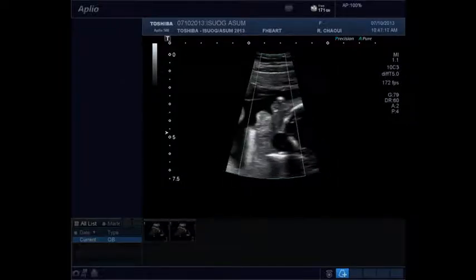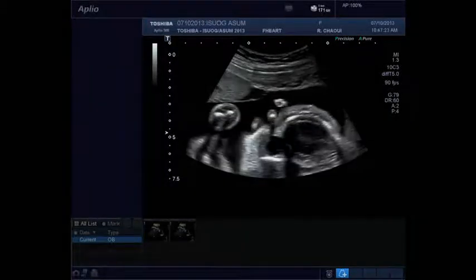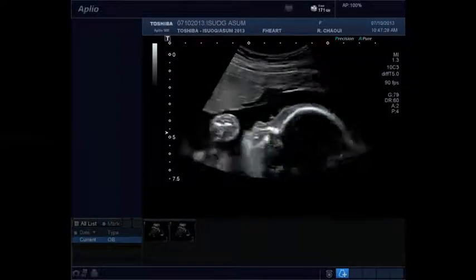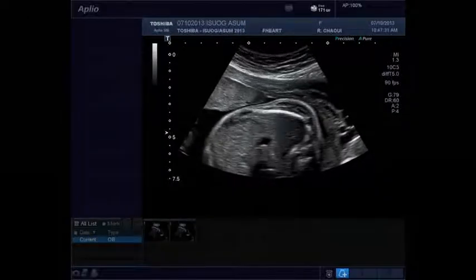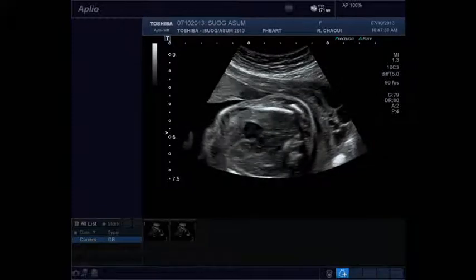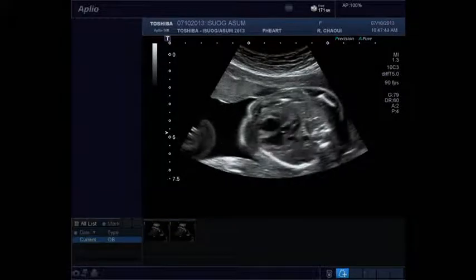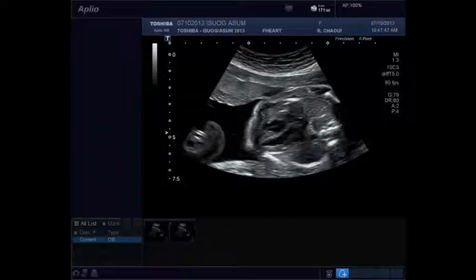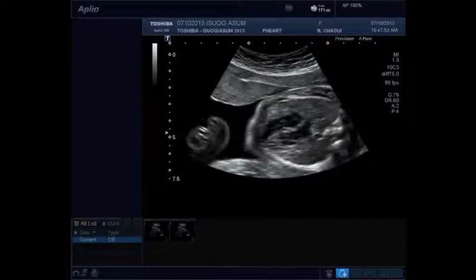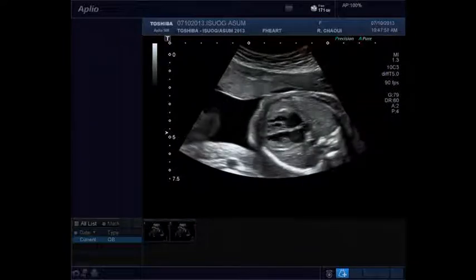Thank you, Alfred. Would you please tell, is there any value if we measure the flow velocity between the ductal and aortic? Any clinical value between this ductal flow and this aortic flow from a clinical point of view? So is the question, is there any clinical value for routine Doppler of valves? Yeah, maybe let's say we want to predict some fetal heart disease like coarctation or maybe PDA in the future of the baby, with this ductal flow velocity.